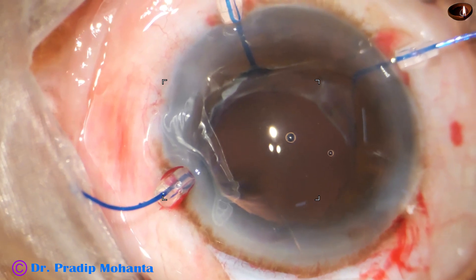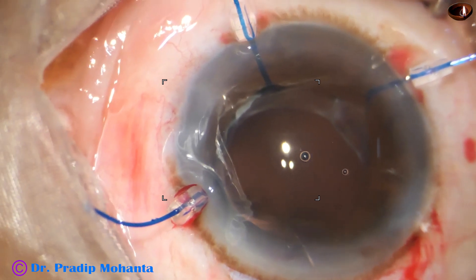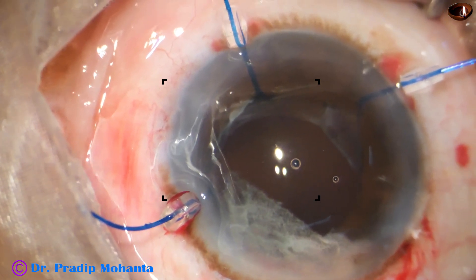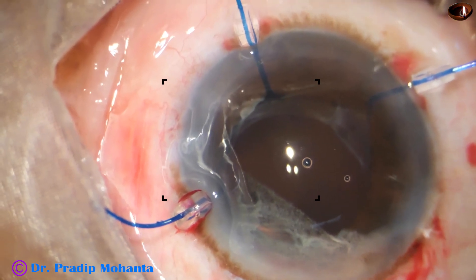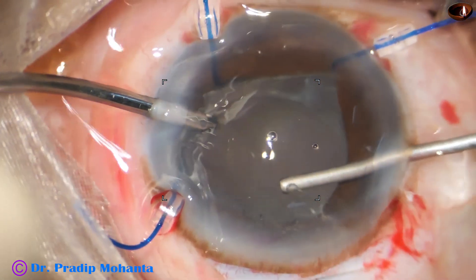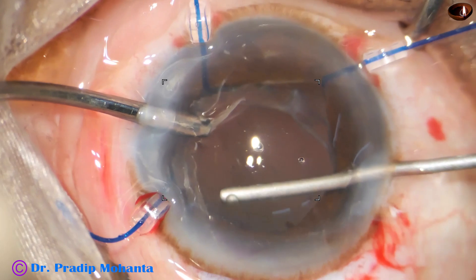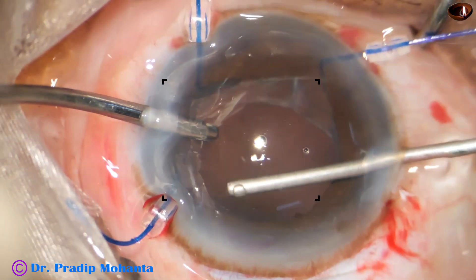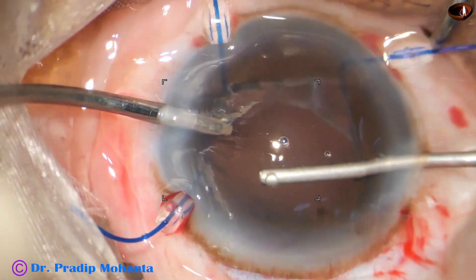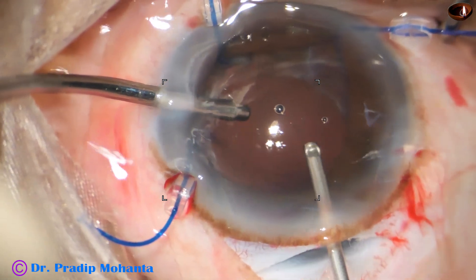I find that there is a vitreous strand coming out of the main wound, so I ask for triamcinolone acetate again and inject a bit of it. We should not inject a lot of triamcinolone — it falls over the macula and a lot of triamcinolone acetate in the vitreous cavity can cause a tremendous rise of intraocular pressure. Now I can see that all the vitreous strands are removed nicely. I can see one vitreous strand coming out through the side port, so I go through the main wound, hook it and cut it.